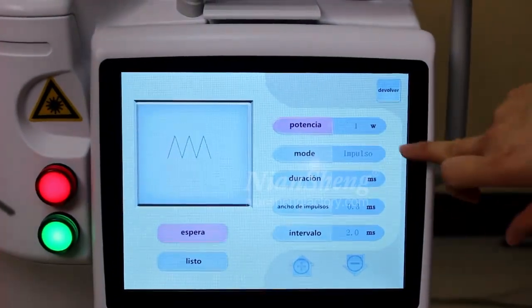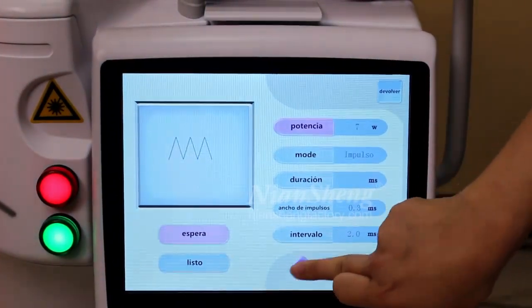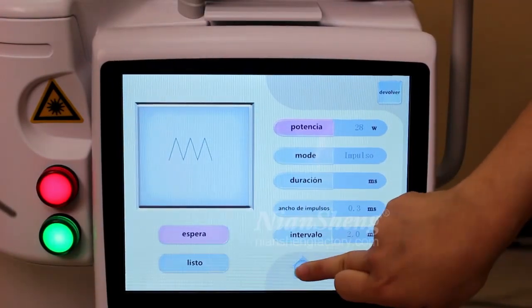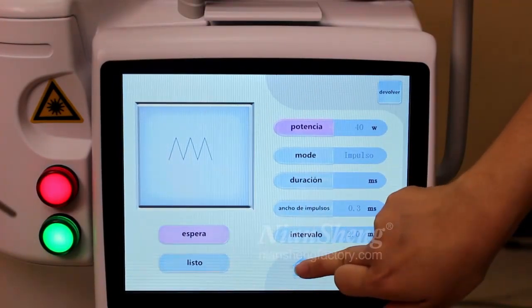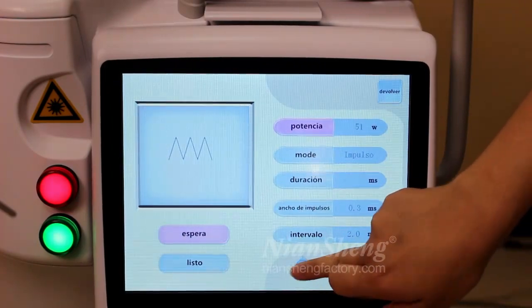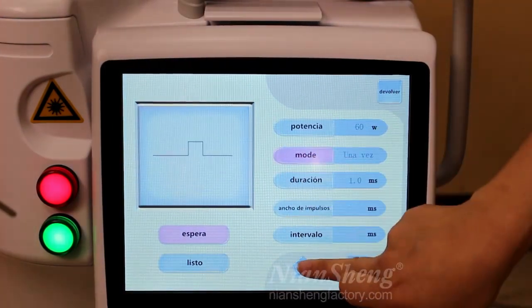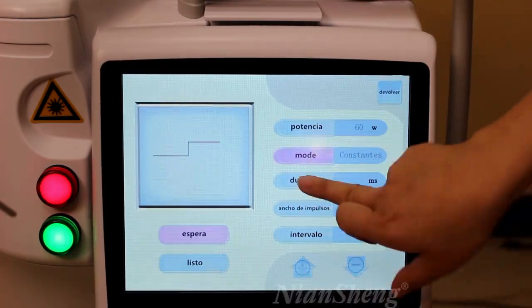Let's adjust the power according to your client's needs. The maximum is 60 watts. And the working mode and the duration.